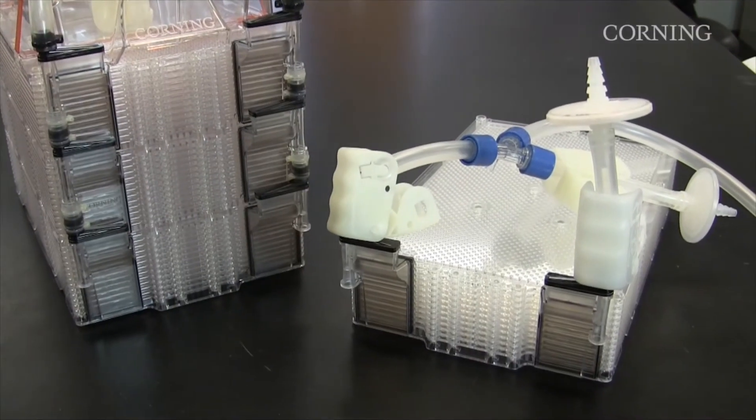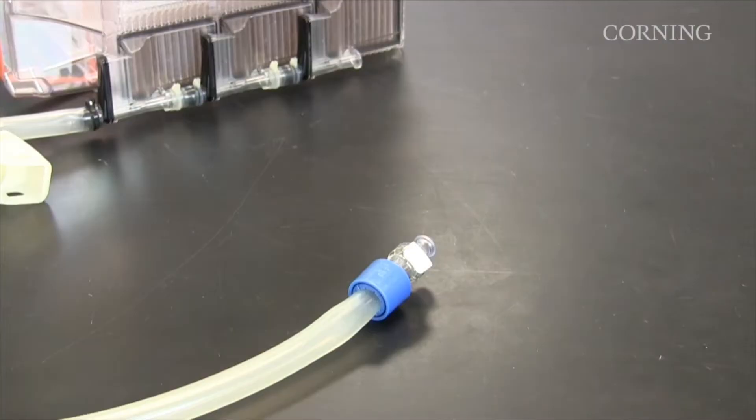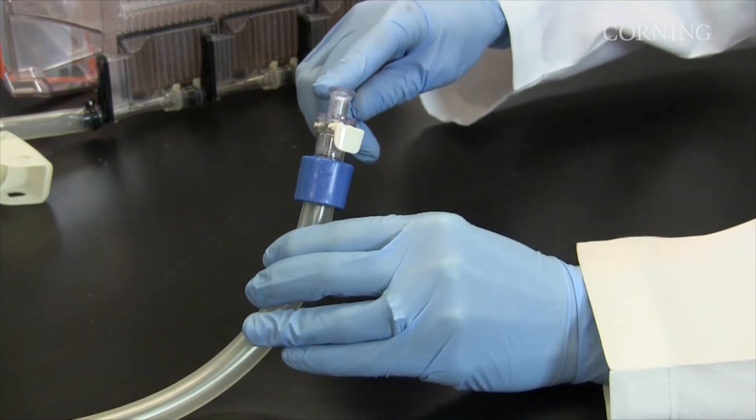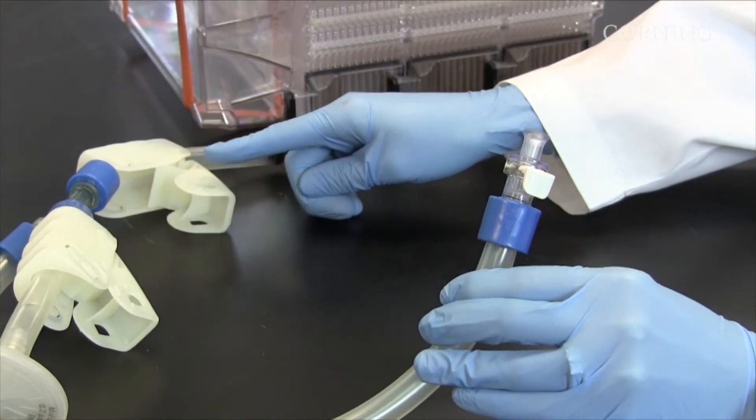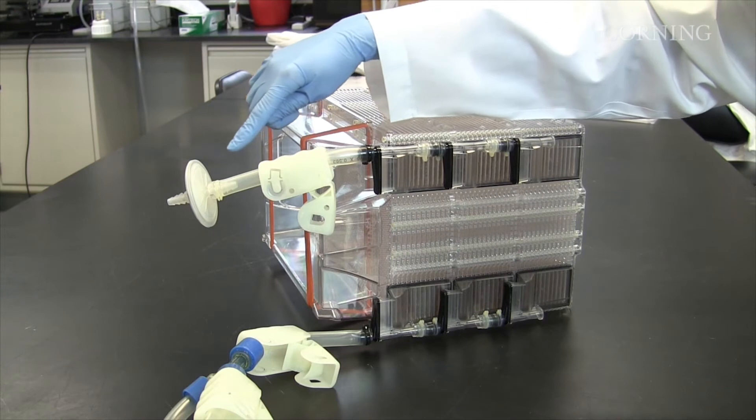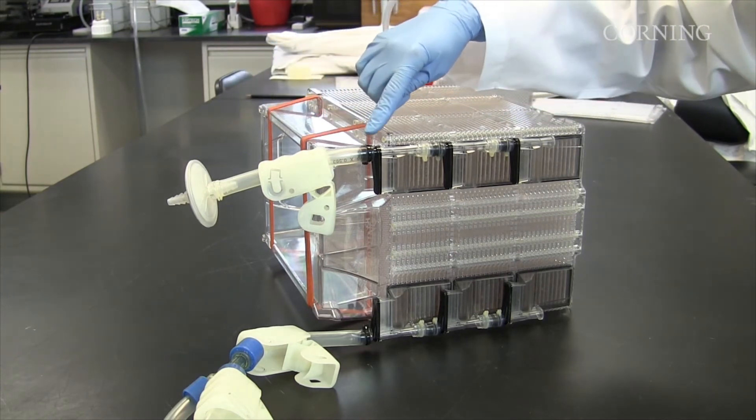The liquid handling tubing is used to make all closed system fluid manipulations. One end has an MPC quick connect for aseptic connections. The other end connects to the liquid manifold. The vent tubing connects the vent filter to the air manifold. It controls airflow and maintains sterility.